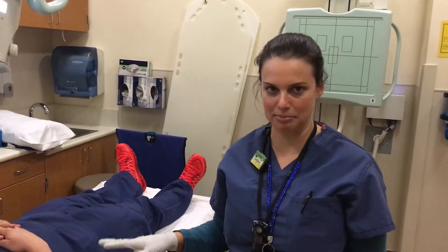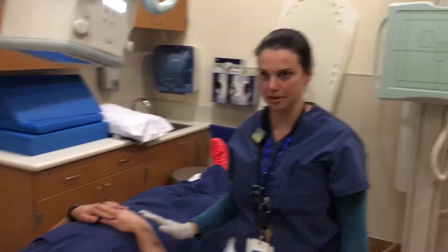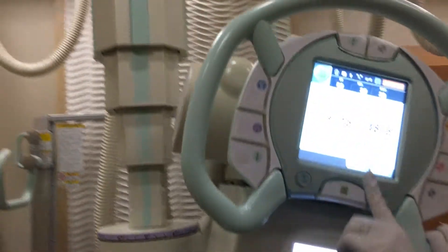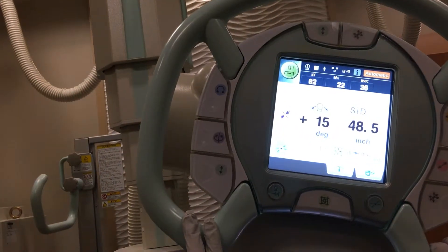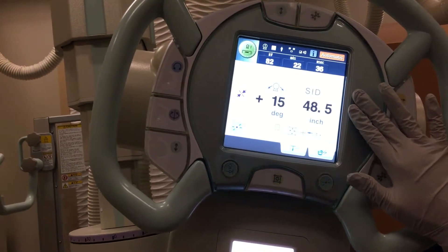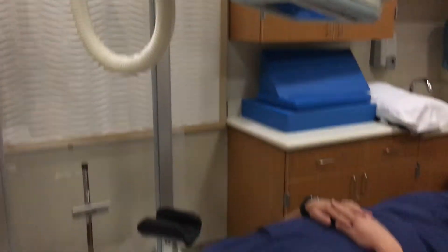For the next position we're going to be doing an AP position. You're going to want to lie your patient on the table. You're going to line up your tube with your bucky at 15 degrees. The book says to do your SID at 40 inches. I personally go higher than 40 inches and I'll explain that in class why I do that.